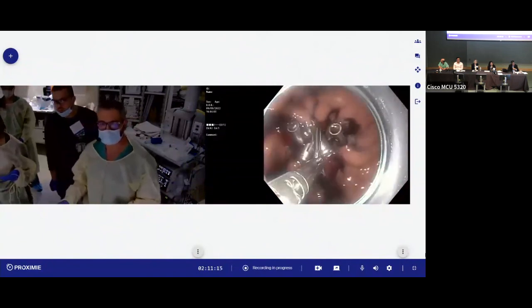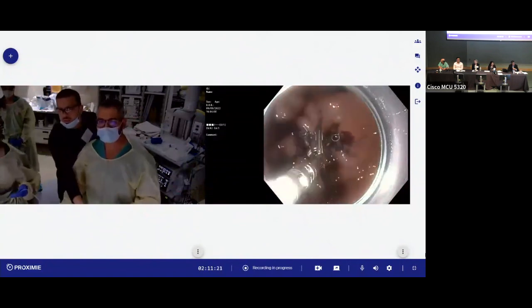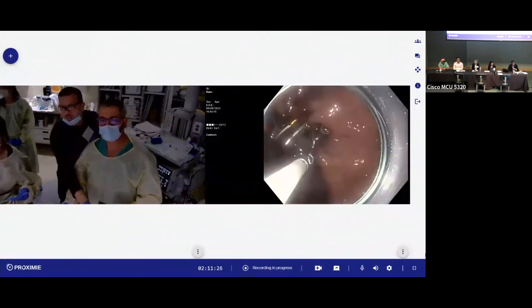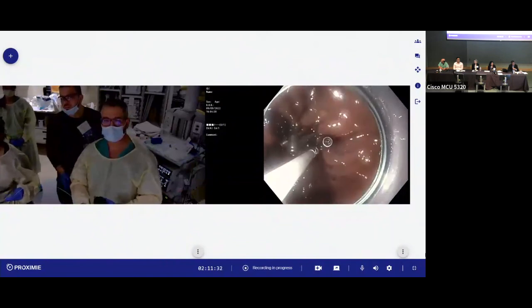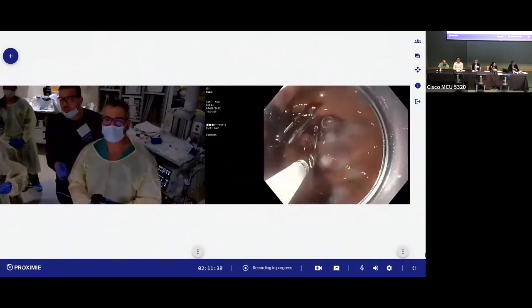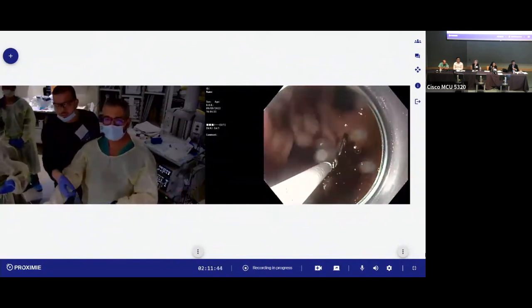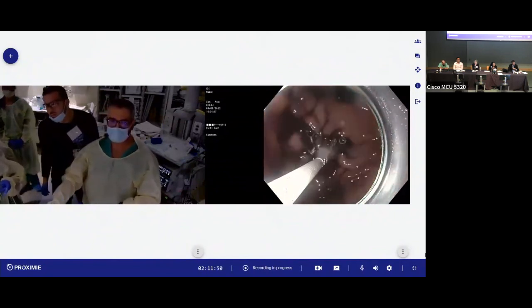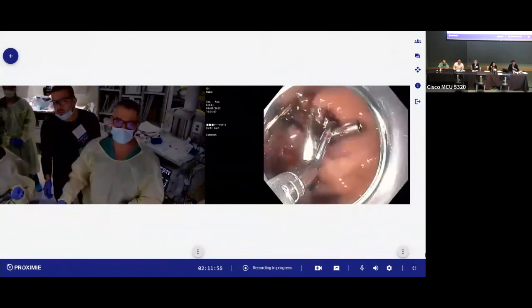Yeah, I might need someone to help me push it in this position. So actually, I still have to go up like that. Yeah, but do not push yet. Yes, now. Now try to close. Actually, I open again. Yeah, commit both sides. And so I will have to go this way a little bit. Yeah, we don't need to push it yet. It's very hard, but we'll get it done.